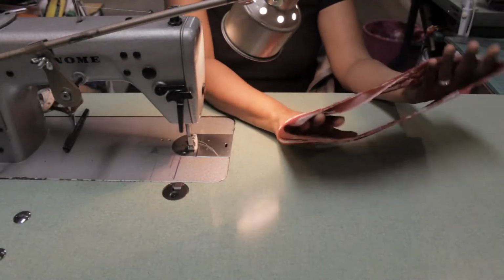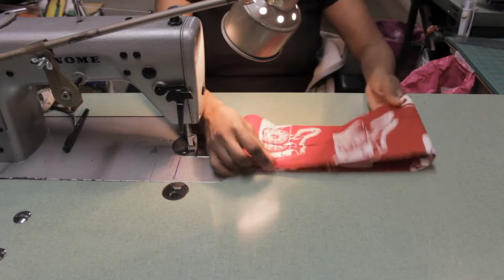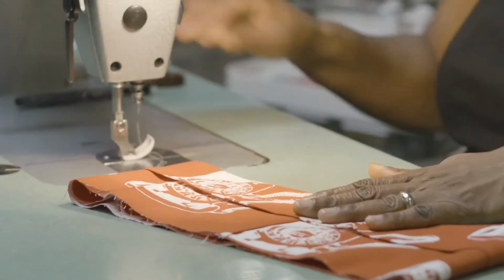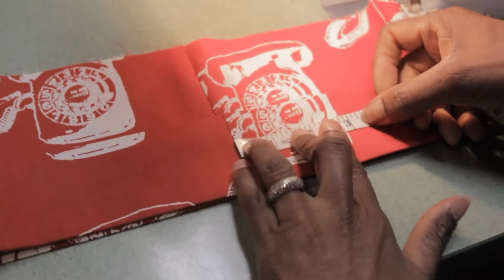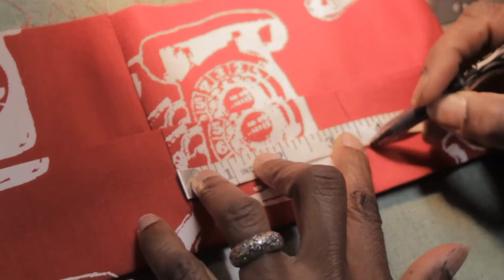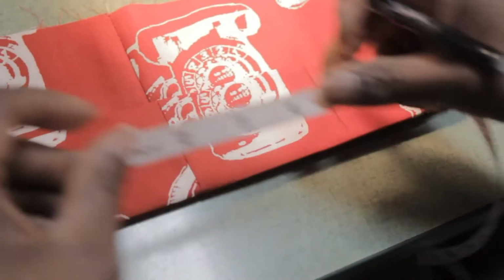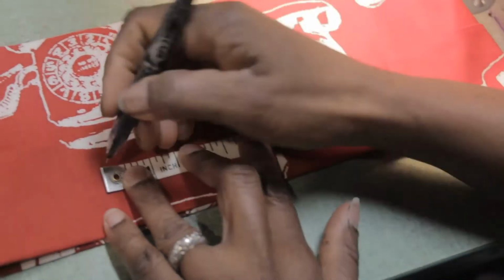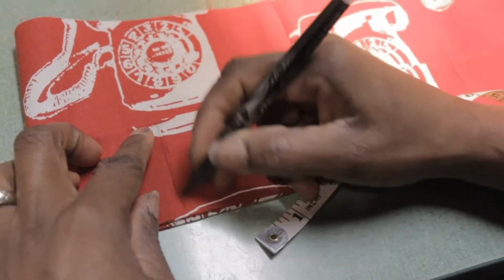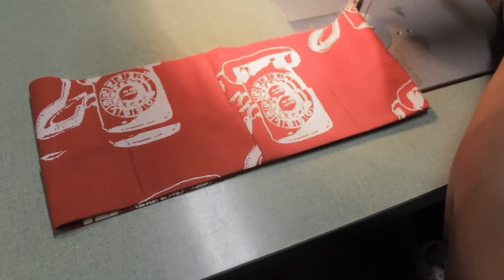Okay, so we now have the band of the scrub cap that has the cuff folded. Now you're going to find the first seam that you made, that's going to be the center back, and you're going to take a tape measure and measure 3.5 inches from that seam out, and make a line. You can make a straight line down the cuff, and then another 3.5 inches on the other side of that seam line, and you're going to make a line there. So I've got my 2 lines, 3.5 inches from this center seam.